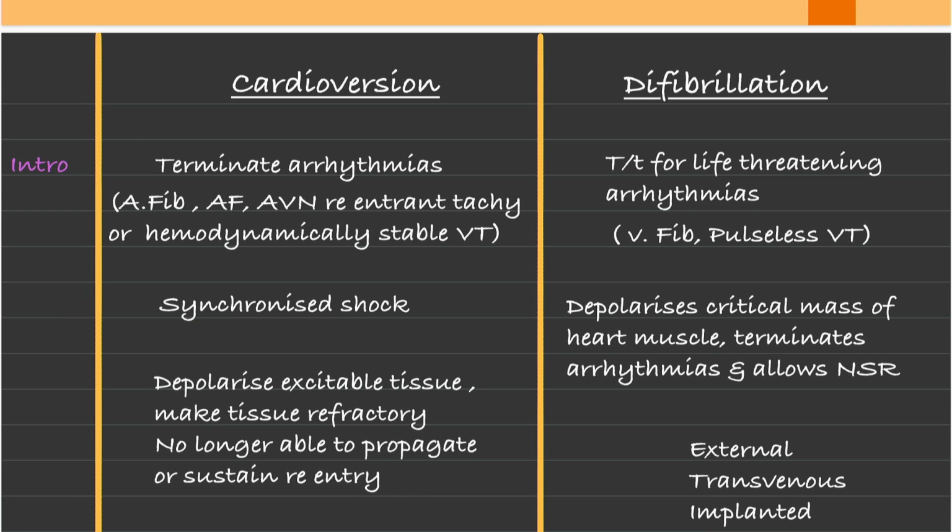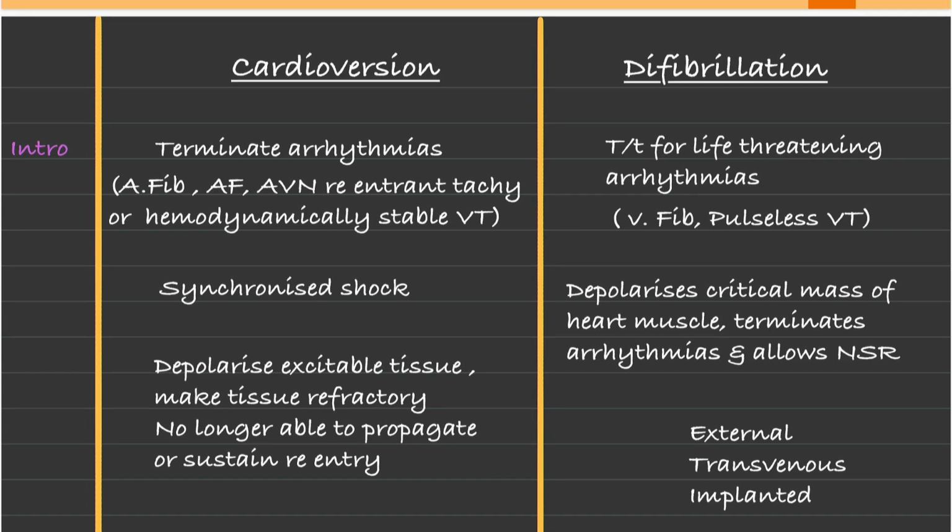During the shock, it depolarizes the excitable tissue, making the tissue refractory. When the tissue becomes refractory, it is not able to propagate or sustain any arrhythmia or re-entry and retains normal sinus rhythm.